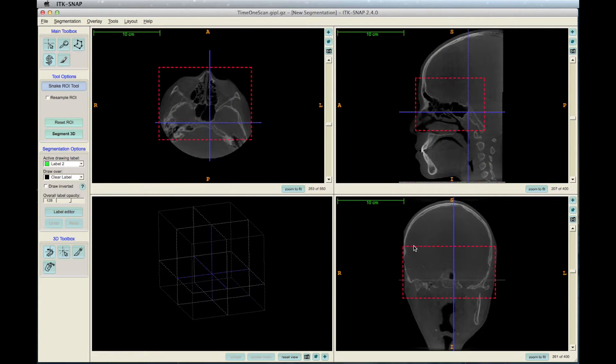Make sure to scroll through all the slices to ensure your region of interest is always contained. When finished, click Segment 3D, which is on the left under the tool options.